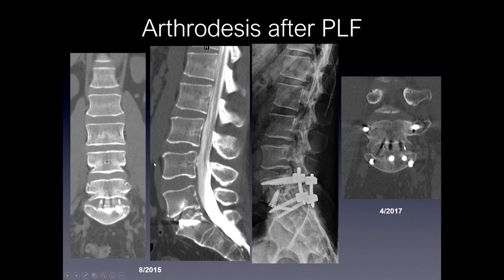Here's an example of pseudoarthrosis after posterior lumbar interbody fusion. There is graft material and screws present, but there's not really direct fusion of this disc space. Because of the lack of fusion, the patient underwent posterior fusion. And ultimately, on follow-up, because of the decrease in motion at that level, the patient ultimately underwent fusion at the L5-S1 level.